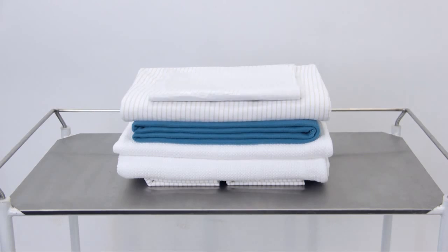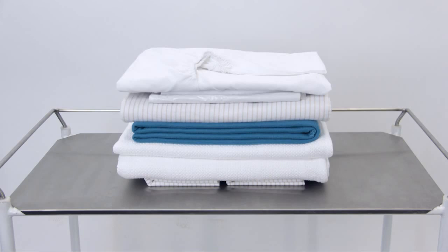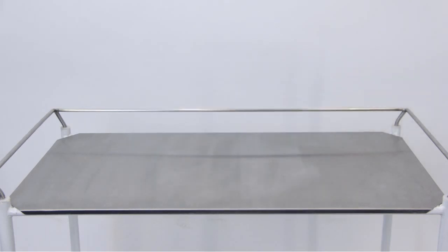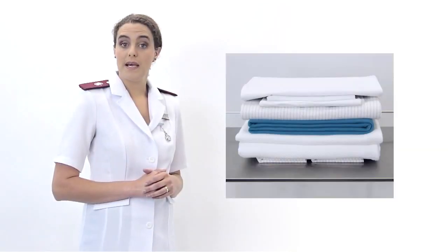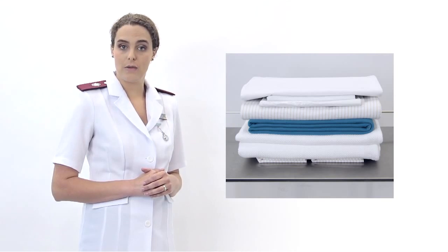a waterproof cover, which may be optional, or use a linen saver, a drawer sheet, which may be optional, and one fitted sheet. If a fitted sheet is not available, use one more large flat sheet. In this presentation, we will make use of a flat sheet. And a clean chair or any other clean surface except the overbed table. Please note, place the clean linen on the clean surface in the exact order it will be used to make the unoccupied bed.